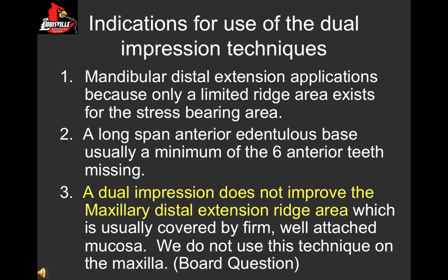A dual impression does not improve the maxillary distal extension ridge, which is already usually covered with a firm, well-attached mucosa, or else you've done surgery on it to create that. We do not use this technique on the maxilla. This is a common board question where they try to trick you into saying that it's needed.